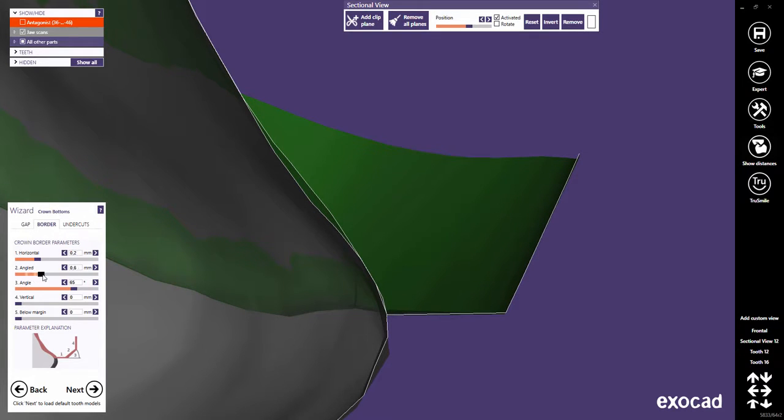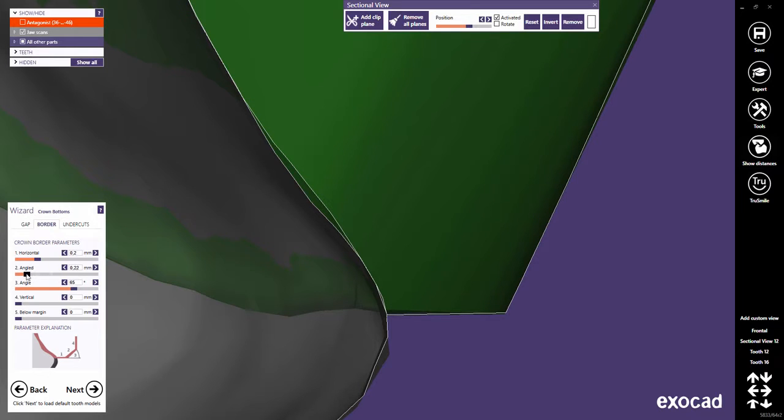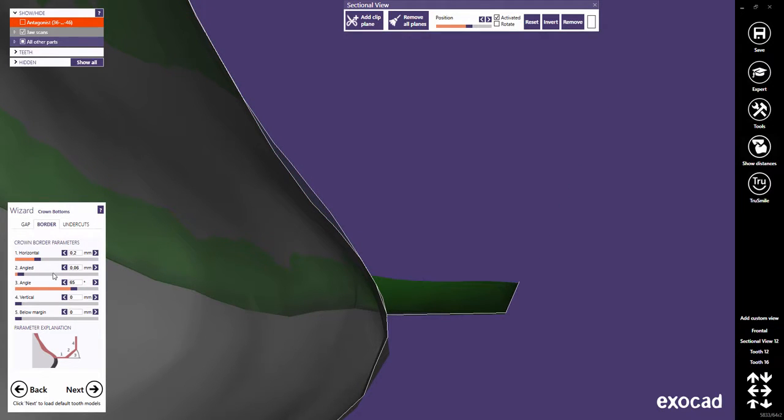Angled defines the length of the border's angled part. This is commonly set to 0 for metal.